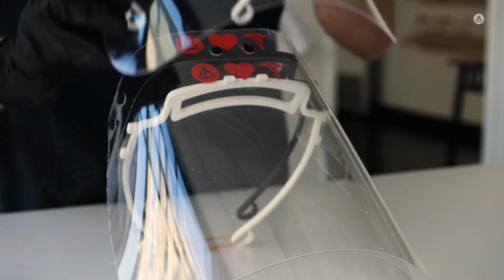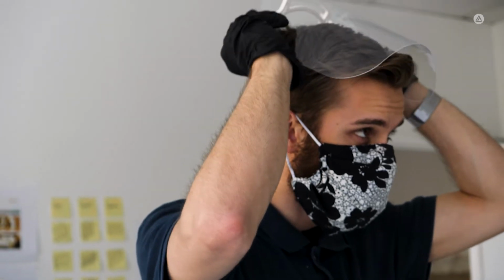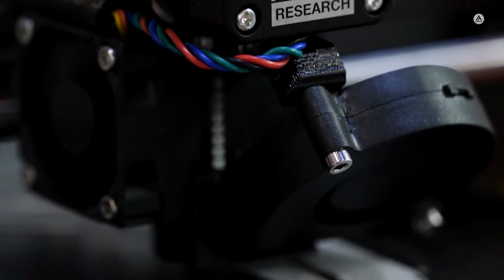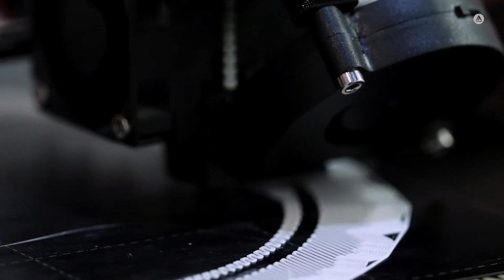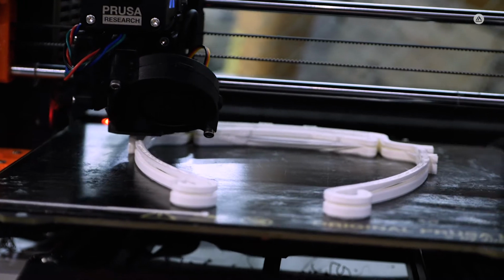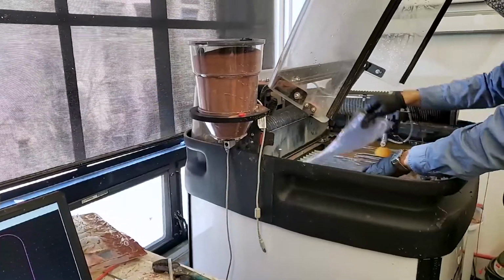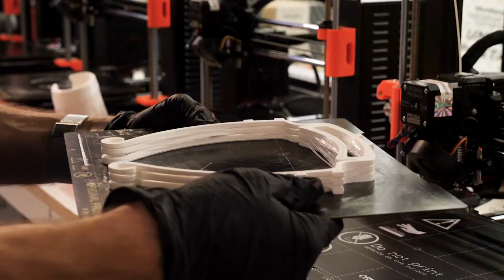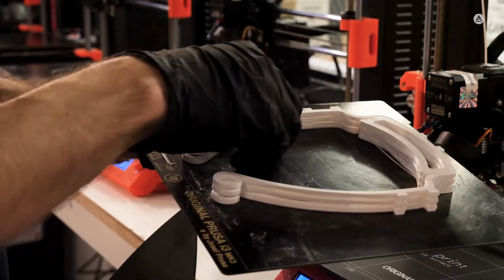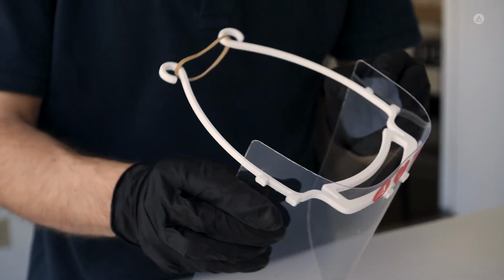Normally, we use our shop to make models of products, cars, jewelry, furniture, and toys. Now, we're changing gears to create face shields, which can be used in addition to a mask to help stop the spread of the virus. This is designed by a Swedish firm called 3D Verkstan, which we modified with validation and advice from our local healthcare providers to make sure that it works properly. We use our water jet cutter to cut polycarbonate sheets, and we 3D print the frames. These snap together for a comfortable fit, which is adjustable with a rubber band.